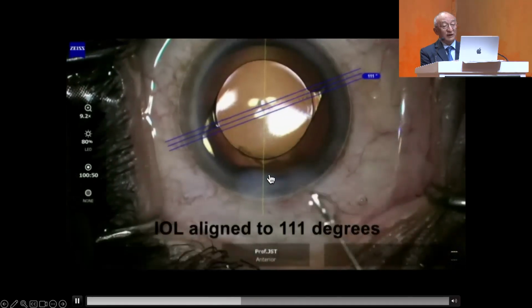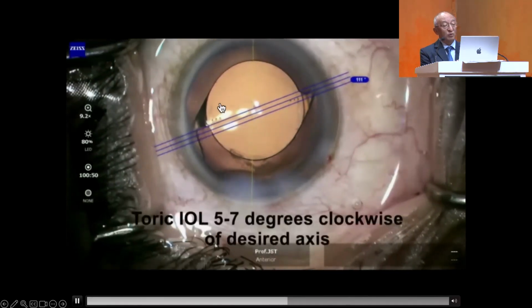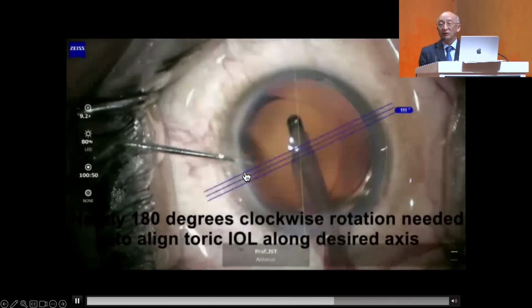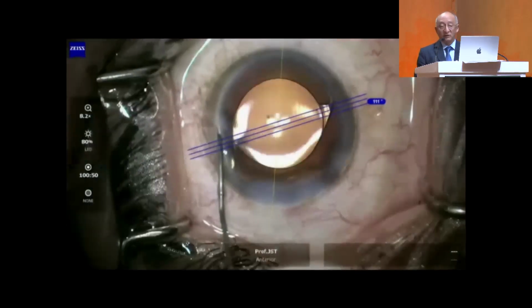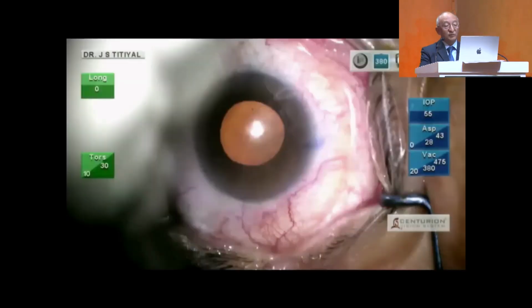By this time with the hydration, the lens would shift. So this is a shift, clockwise. So this lens cannot be rotated anti-clockwise. So that's why there's always a tip: keep your lens a little anti-clockwise when you are doing the hydration manipulation, so that you can shift the lens clockwise, which is easier also. Manual marking should be very sharp.